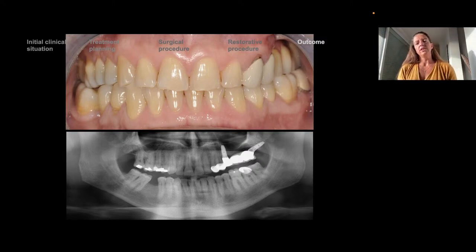As you can see, this is another option that I like to share, because many times we have the tendency, from what you hear in traditional lectures, to use straight implants, but tilting the implants also applies to partial cases. This is something that is very common for me.